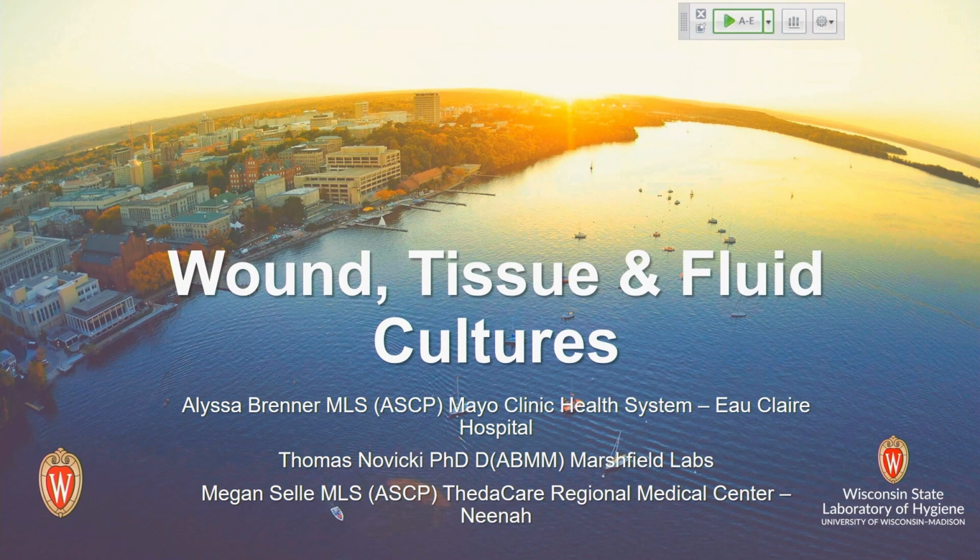Yes, Ray. On those prosthetic joint tissue cultures, we put a process in place to incubate those in blood culture bottles. There's a lot of good literature on that process. When you incubate in blood culture bottles, you need only 3 or 4 separate tissues instead of 5 or 6. When we were doing our validation, I think we found 17 more significant positives growing them out of blood culture bottles than we did doing it the traditional way.